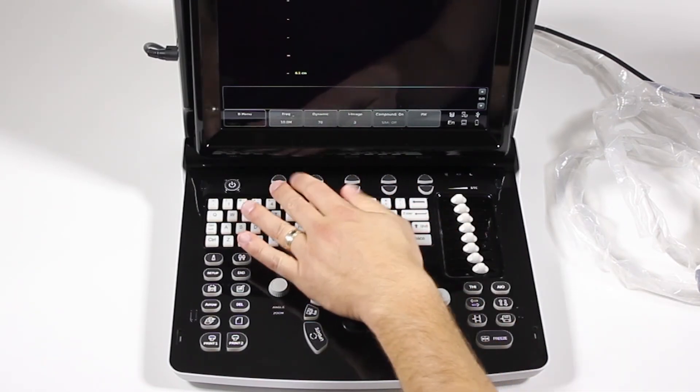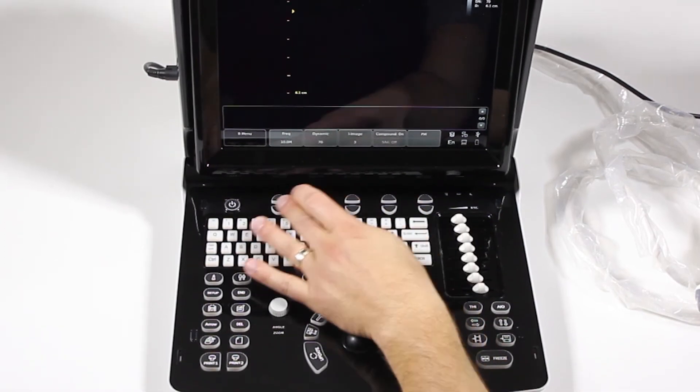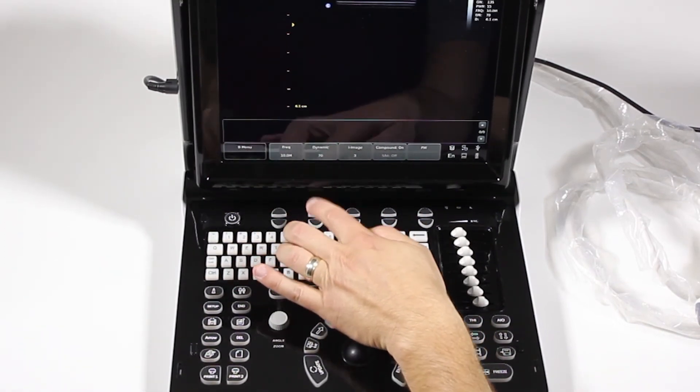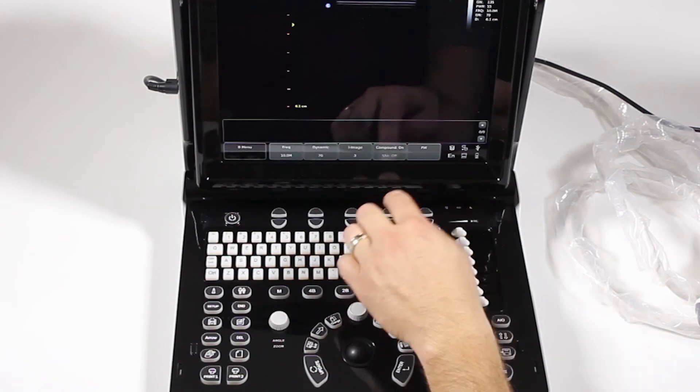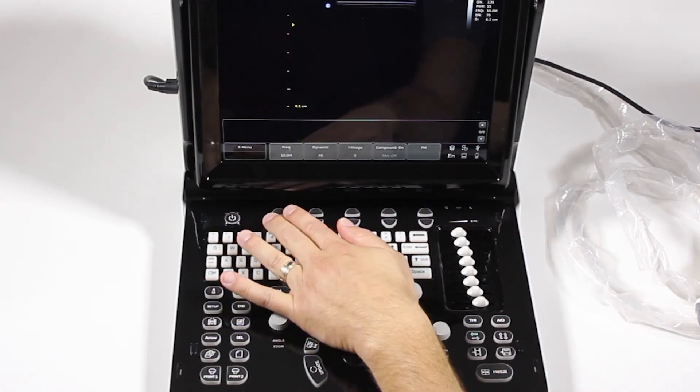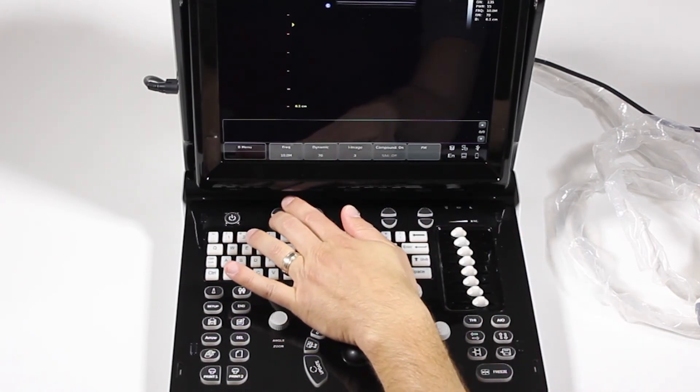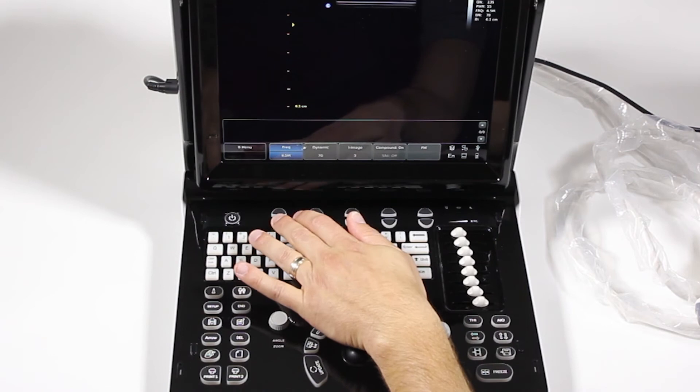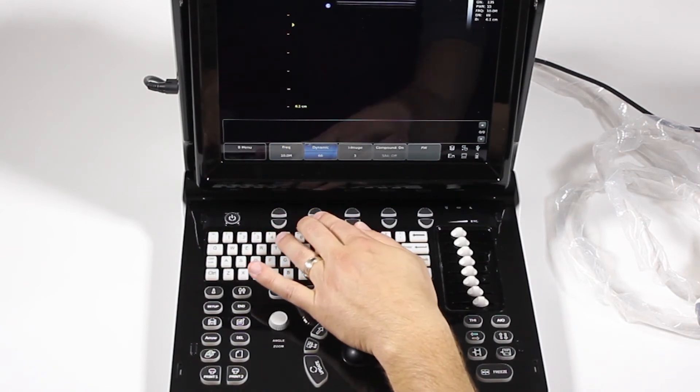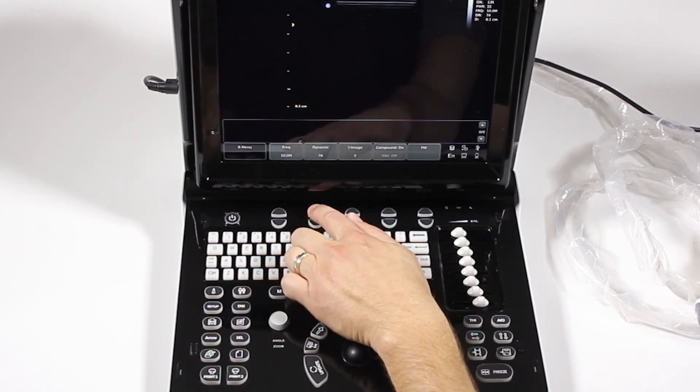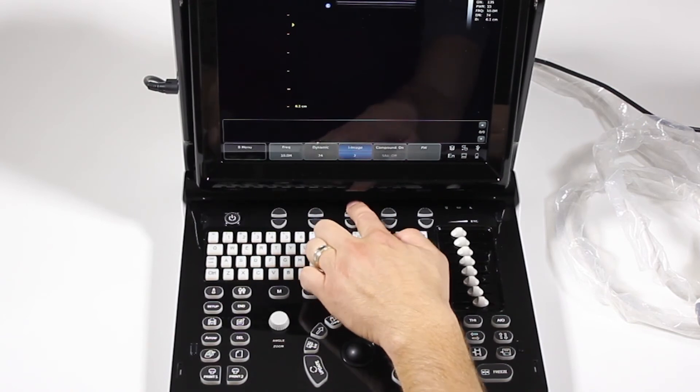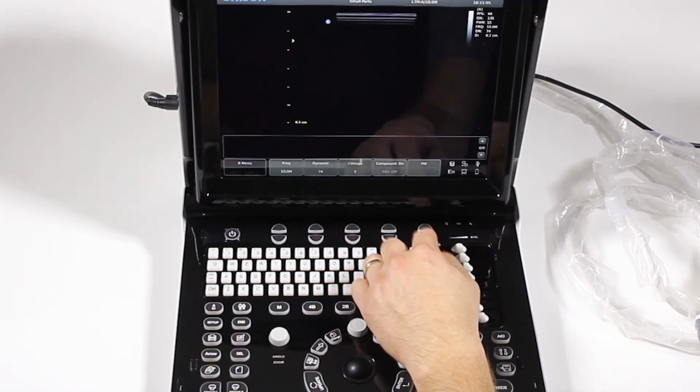Across the top here, we have what are called soft keys. So we have soft keys that all refer to these boxes down at the bottom. So if we want to change the frequency, we would push one of these up or down to change that parameter. So here we push down, and that value goes up or down, and that's what these soft keys are here.